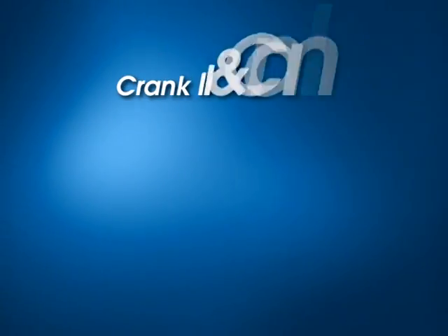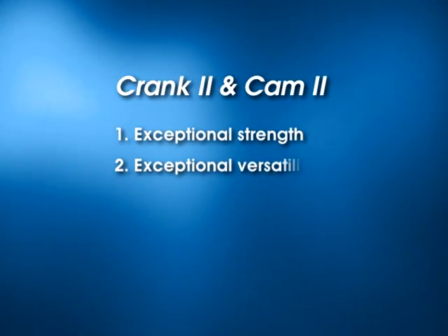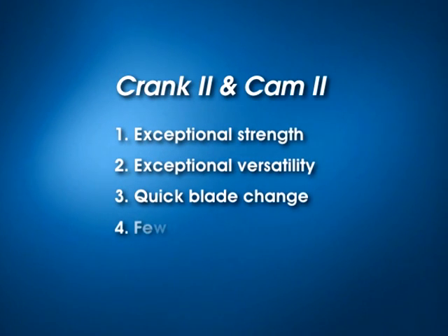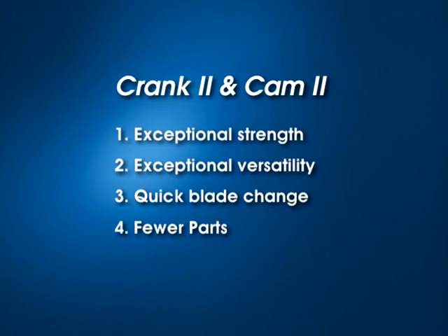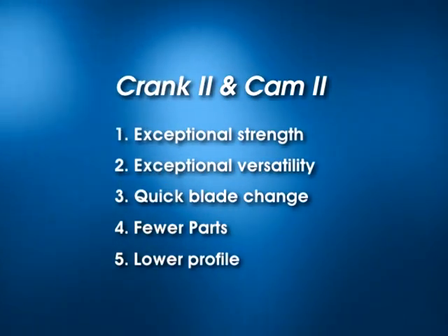The Crank 2 and Cam 2 clip-on joints provide exceptional strength, exceptional versatility, quick blade change, fewer parts — therefore simpler instrument counts — and lower profile for easy access to the incision.